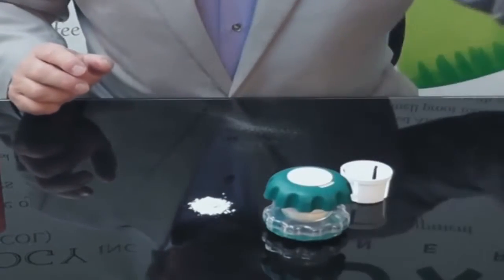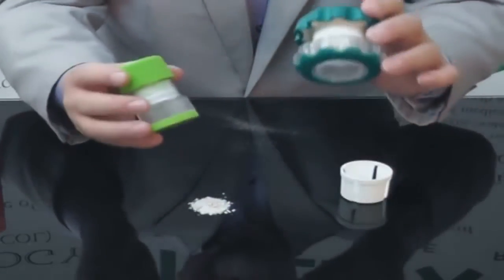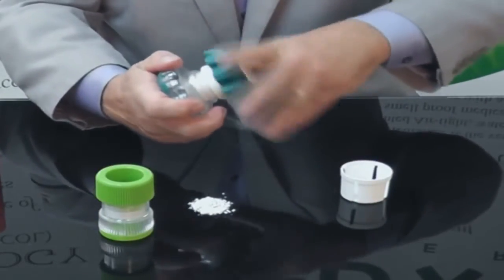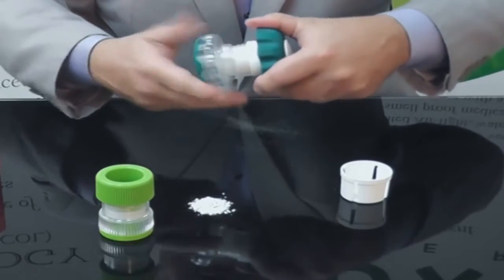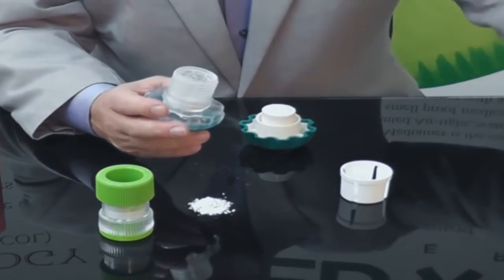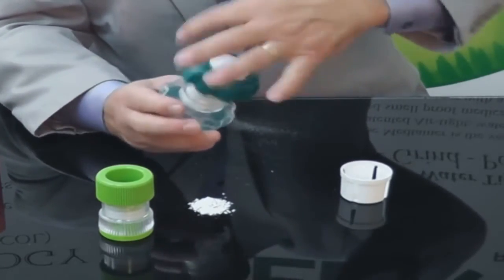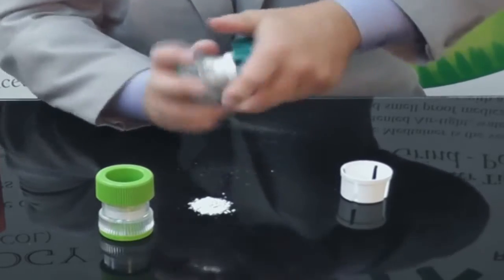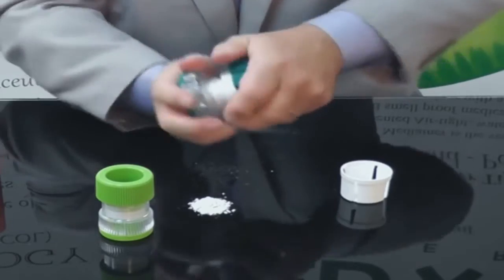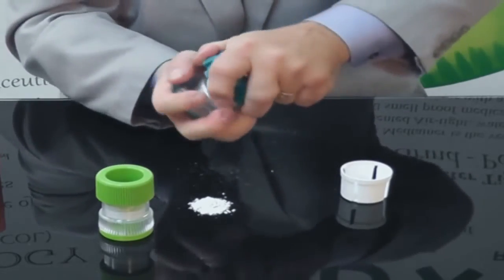These are commercial pill crushers and pill grinders. One comes from CVS, one comes from Walgreens. Let me show you how the pill crusher works, basically with the same amount of medication. So we place the medication in the pill crusher, and then it's essentially just a pressure thing. And again, from a resistance standpoint, almost anybody can do this. We're going to do this a couple of times, okay?